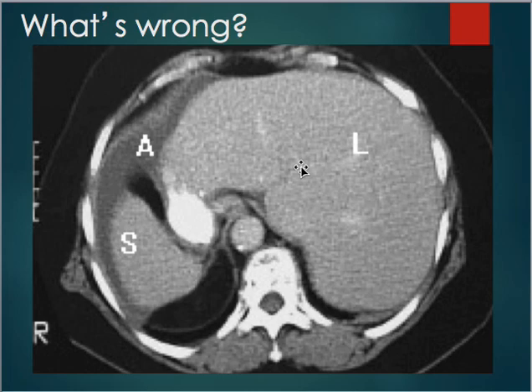Can anybody tell me what's wrong with this image? So this is an abdomen image because you can see the liver here and the spleen here. What's wrong with this patient? Or stomach, I'm sorry, I said spleen. It's actually on the wrong side. So this patient has situs inversus, where the anatomy is reversed and on the incorrect side.